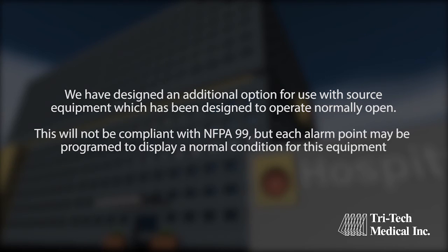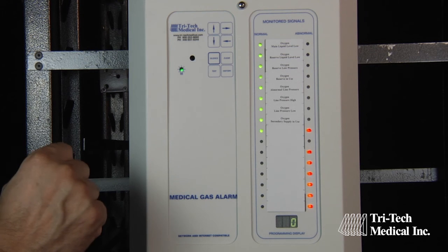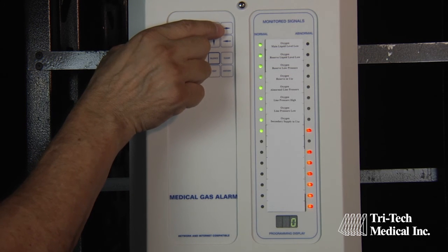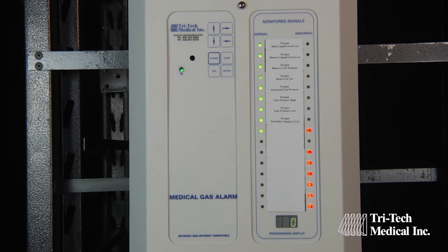An additional option has been designed for use with source equipment which has been designed to operate normally open. This will not be compliant with NFPA 99, but each alarm point may be programmed to display a normal condition for this equipment. When the signal points for this equipment have been selected using the right arrow button, the letter O will be displayed on the LED display at the bottom of the circuit board. Using the up or down arrow button, the blinking green LED may be selected and then saved using the left arrow button.